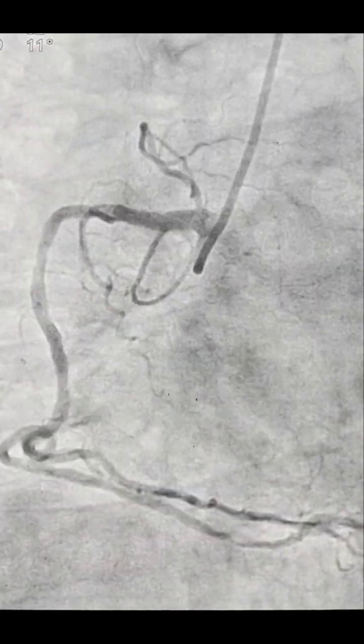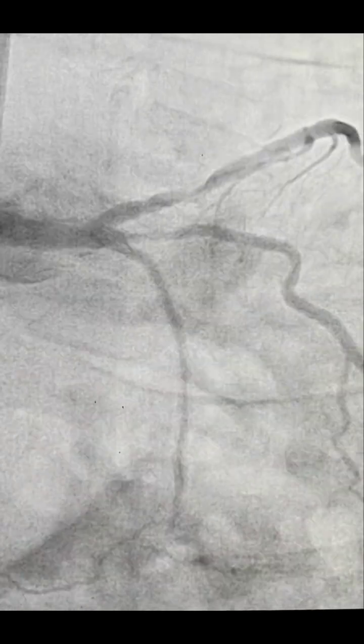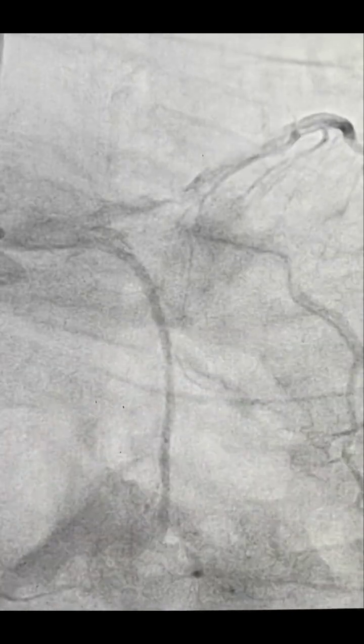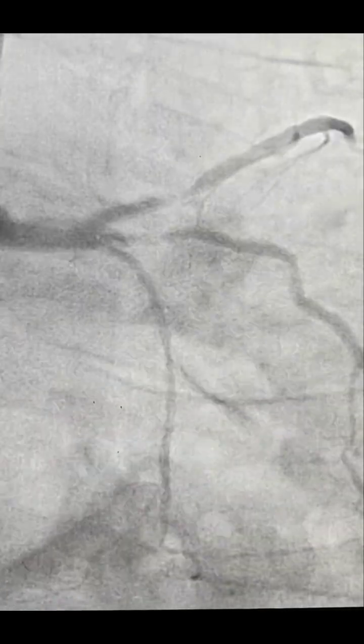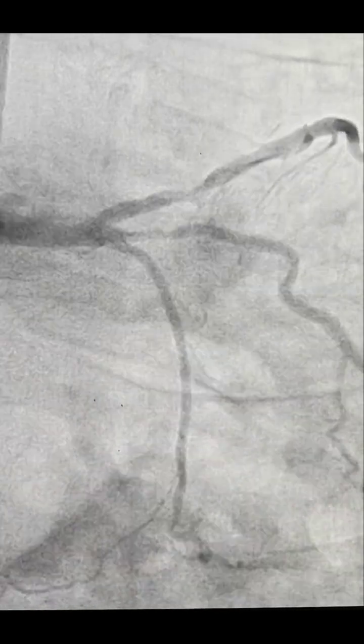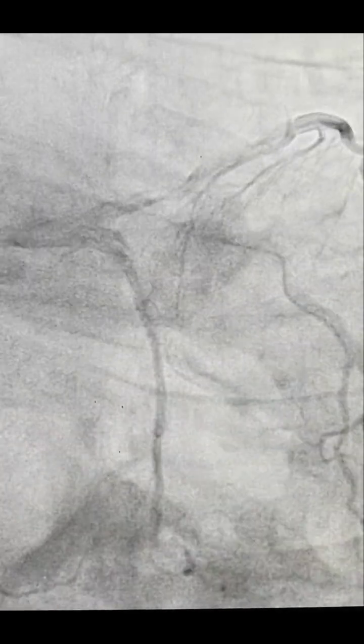And this is the RCA. There's a mild stenosis in the proximal RCA. So as soon as I see the Wellens pattern on the ECG, I suspect the LAD. That's a bit obvious, and you can see the high thrombus burden, and that extends to this Ramus also.